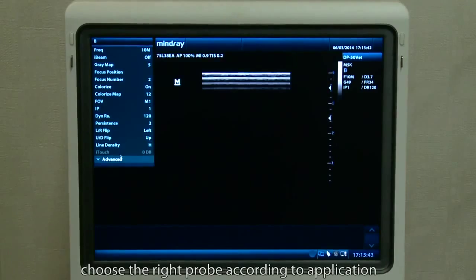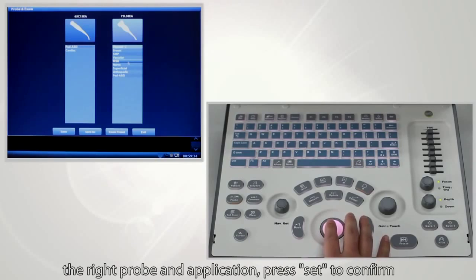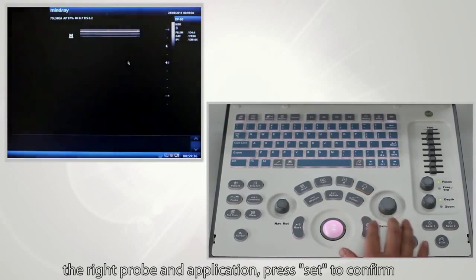Choose the right probe according to the application. Press the probe button, roll the trackball to select the right probe and application, then press Set to confirm.